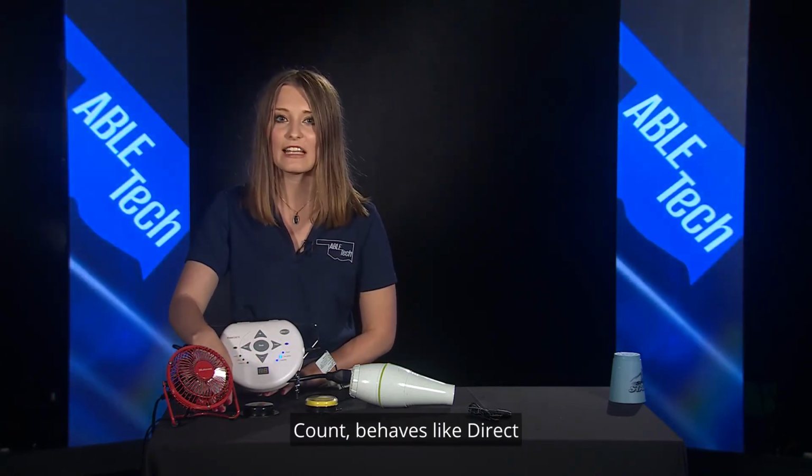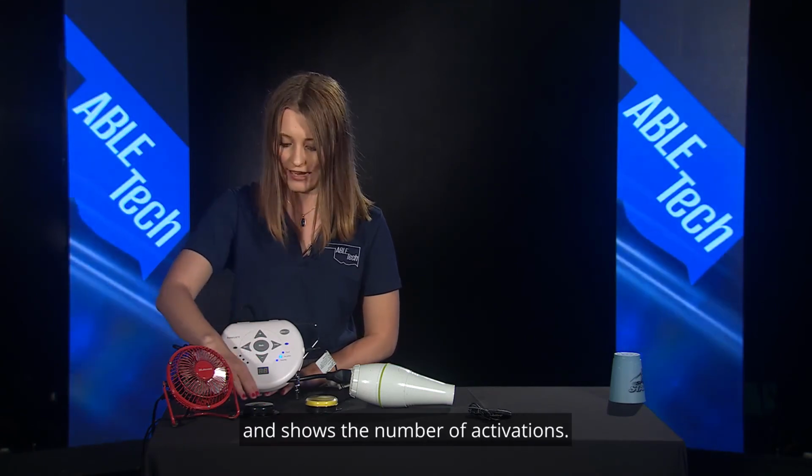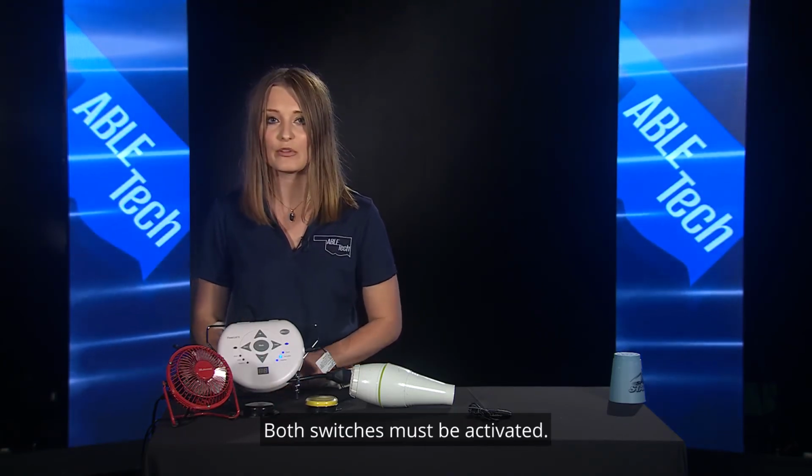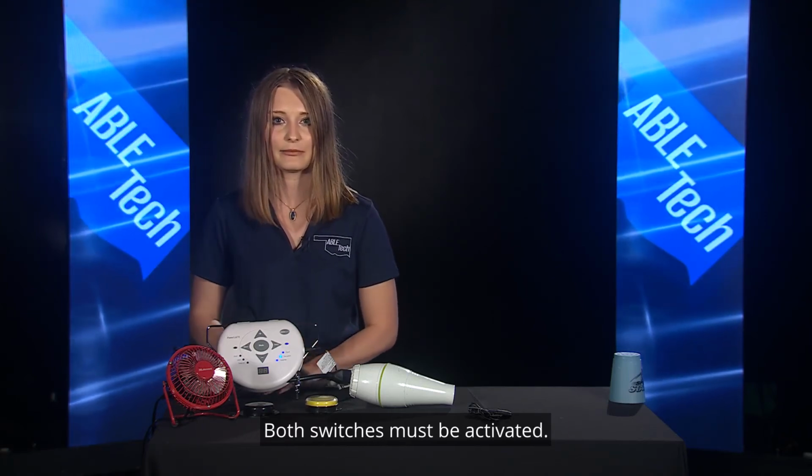Count. Behaves like direct and shows the number of activations. Two switches behaves like direct. Both switches must be activated.